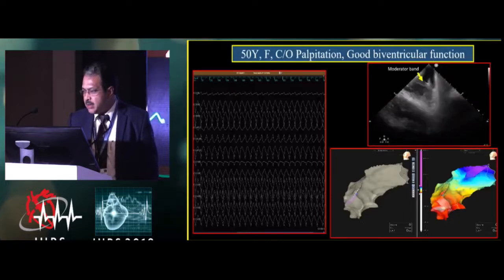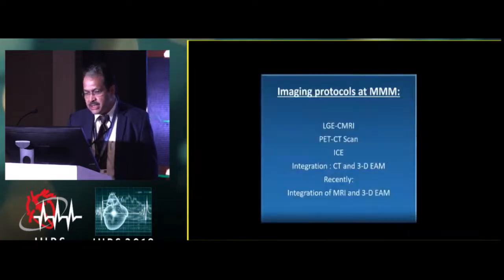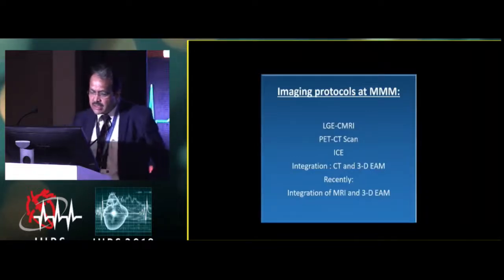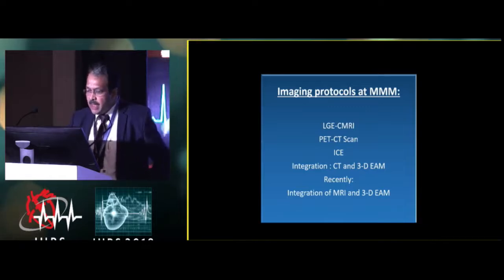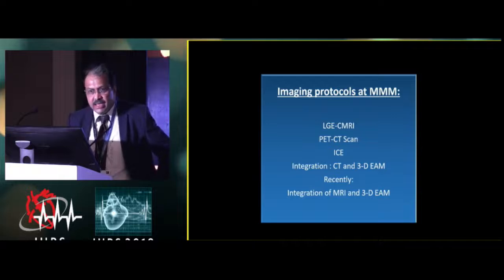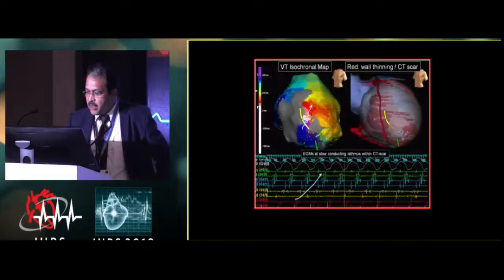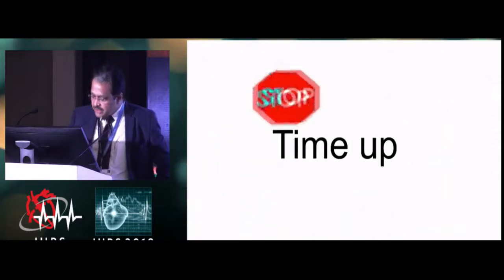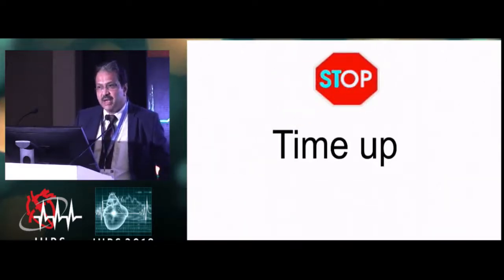Similarly, the moderator band, again integration. At our place, the imaging protocols, especially for scar-related VTs, are LGE CMRI, PET-CT, ICE, and the integration of all these images. Recently, our radiologists are interested in looking at the MRI-derived scar information on top of the CT plus the electro-anatomic mapping.